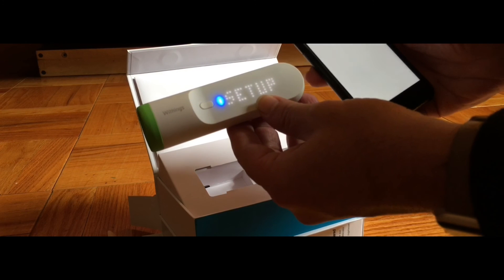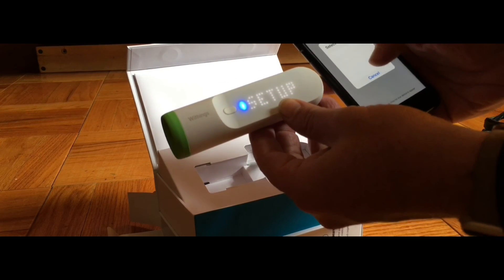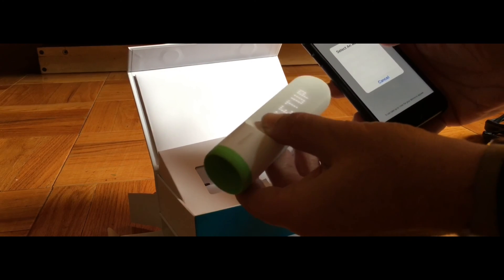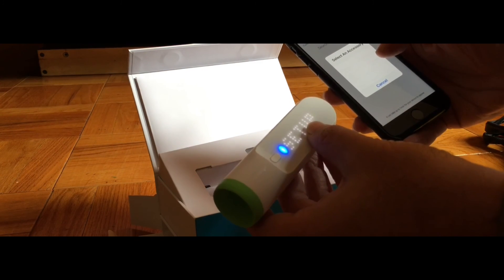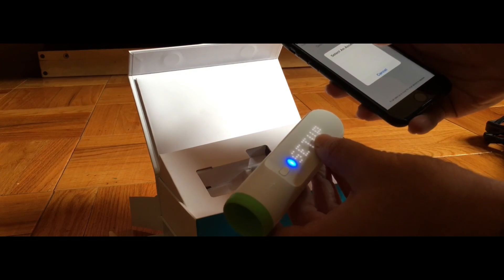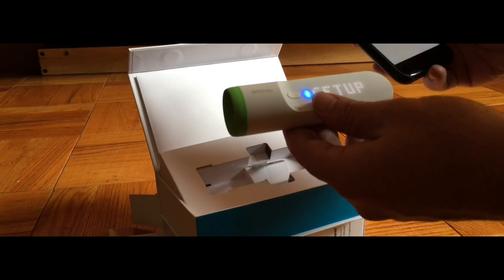It's got a touch interface, so once it connects to your Withings account — I had four people on my account — you can take the temperature and then say which account you want the data to go to. The touch interface is a little cumbersome; it's not exactly the most robust touch-sensitive interface, but it works. And if you don't assign it to a particular account, it goes to a default setting and you can assign it later.